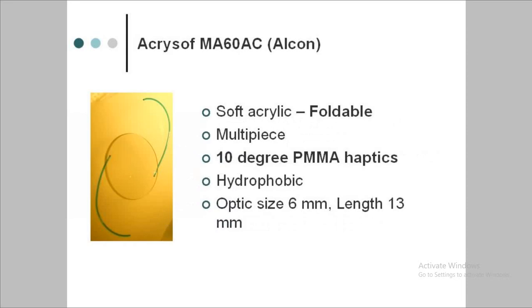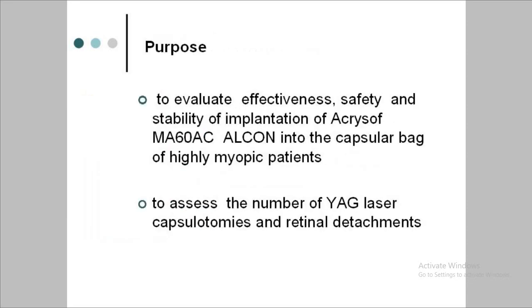And that's why now the foldable IOL with 10-degree PMMA haptics is available.